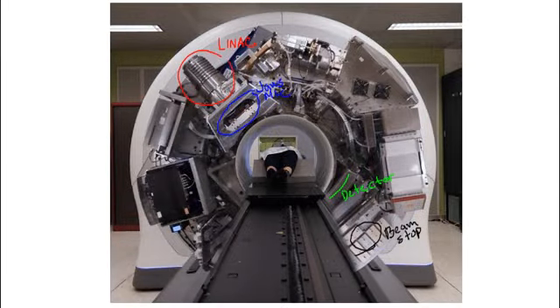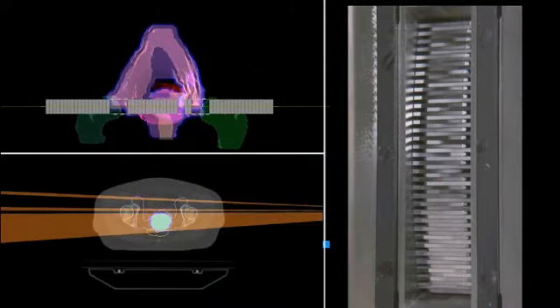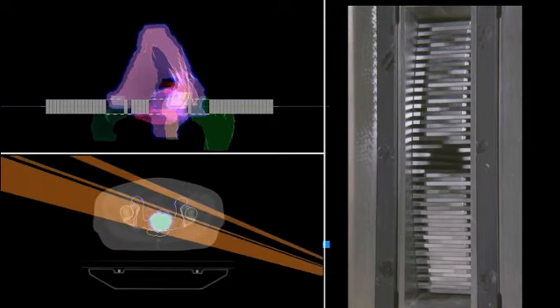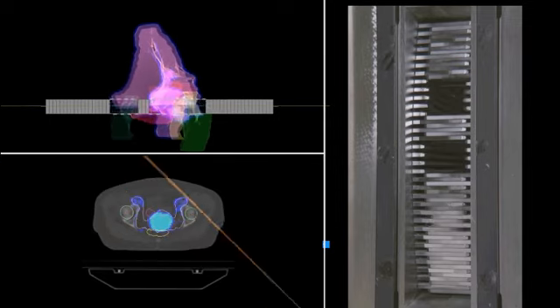If you look at the components, you have the LINAC, MLC, the detector, and a beam stop. The MLC is a little different, though, than the MLCs that we've been looking at. It delivers modulated dose by opening and closing, like this. So it's either open or closed. This is called the binary MLC. It opens very quickly, delivers modulated dose in a slice.